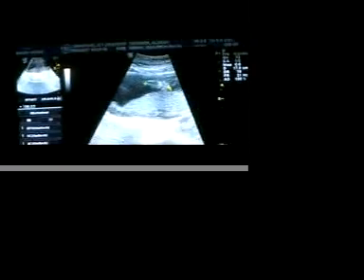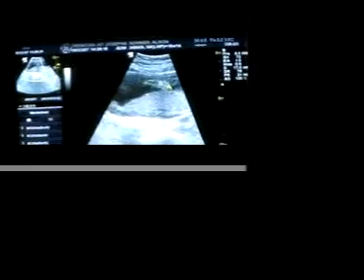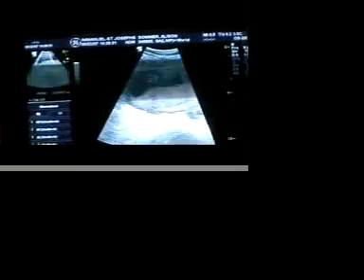From the toes to the heel, it's about 2 centimeters, so about this big. Wow. Pretty tiny. It's as big as the whole baby was last time. And there's that other foot right next to it, so it must be one foot in front of the other. Stubborn baby, come on. Let's see, there are those lines I'm talking about. See? Okay, 80% sure it's a girl.